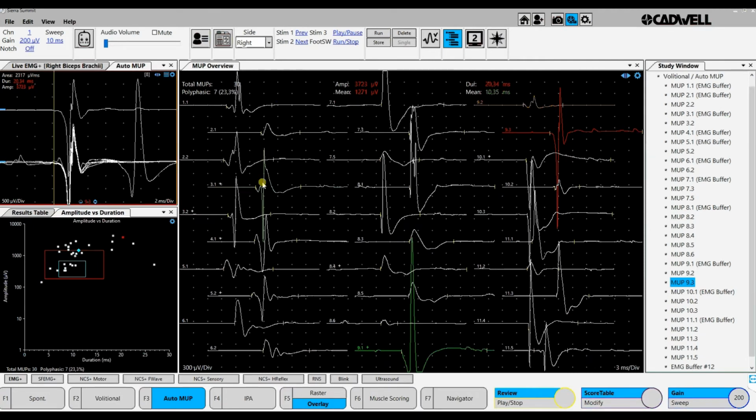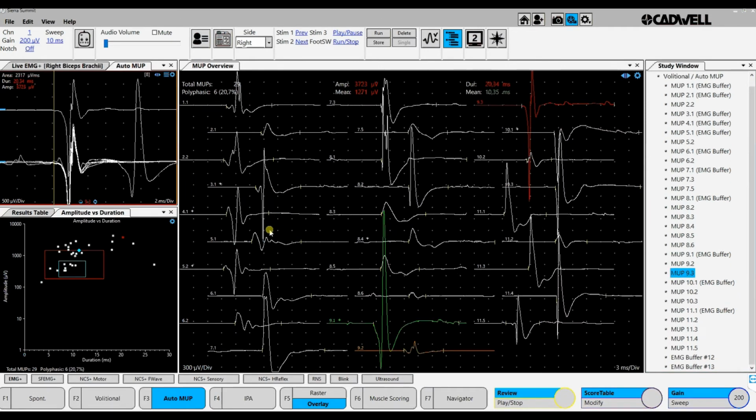I look at copies first. Here is a copy, and they are slightly different, so the computer has considered them as different, but I don't believe that. And so that happened to be a subjective thing.